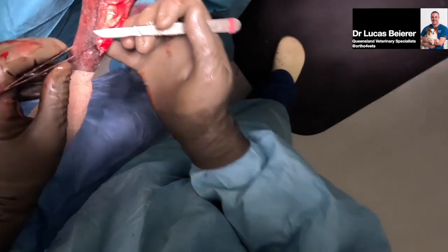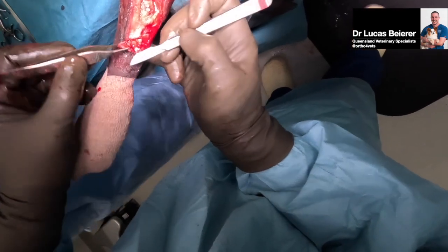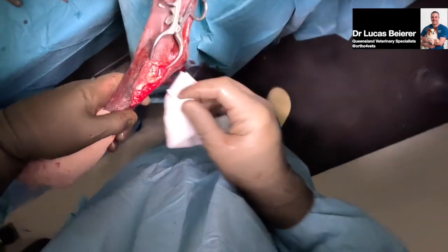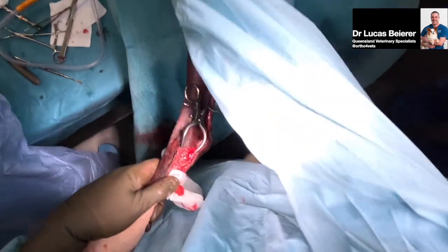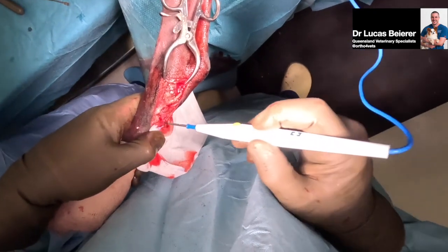Aha. Dr. Bird. How you going? Good, how are you? So that's your central tarsal bone screw? No, we've already done that. So that's that little slither of calcaneus. Oh, right, sorry. Yeah.